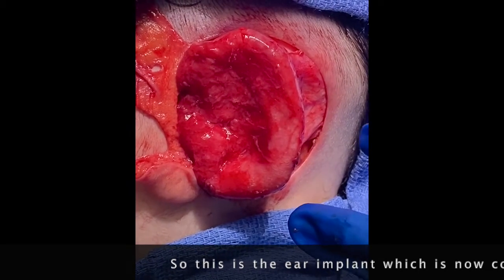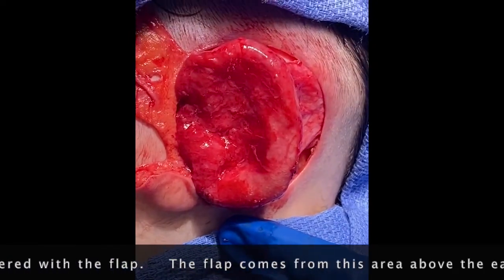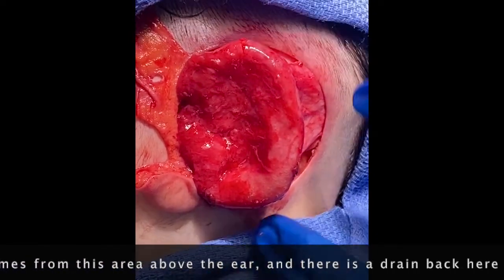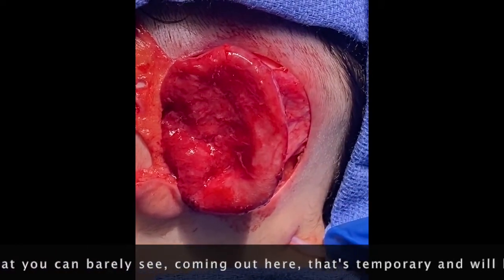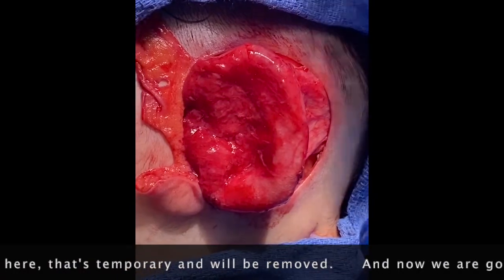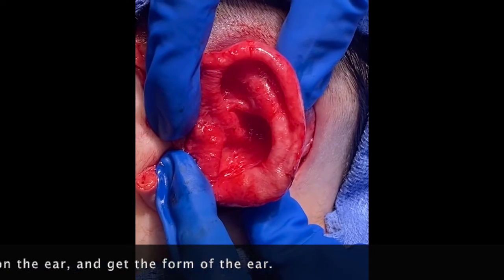This is the ear implant, which is now covered with the flap. The flap comes from the area above the ear, and there's a drain back here that you can barely see — that's temporary and will be removed. Now we're going to put suction on the ear and get the form of the ear.